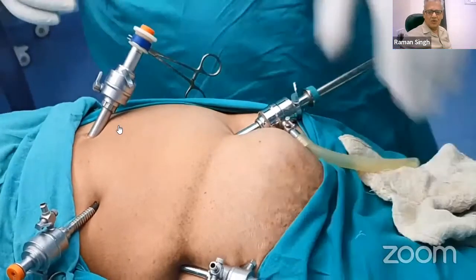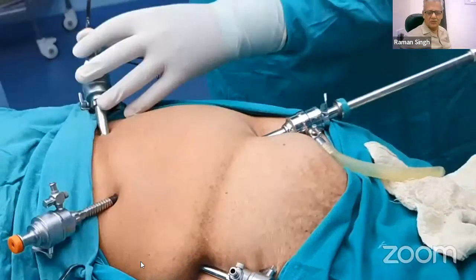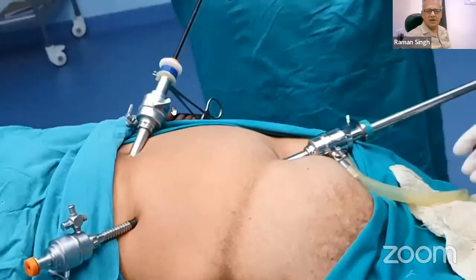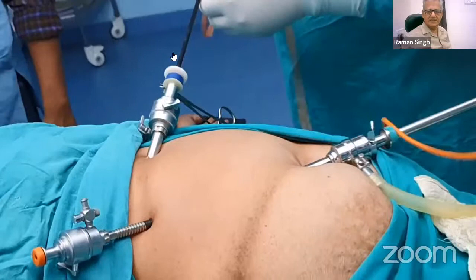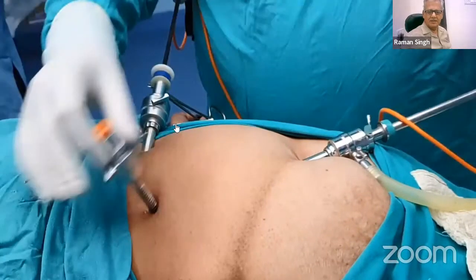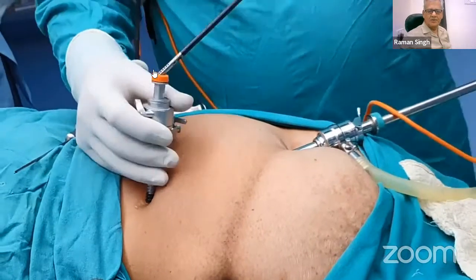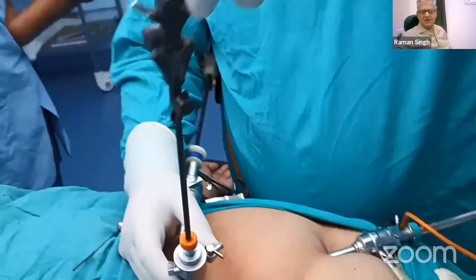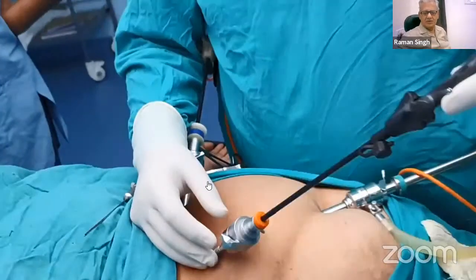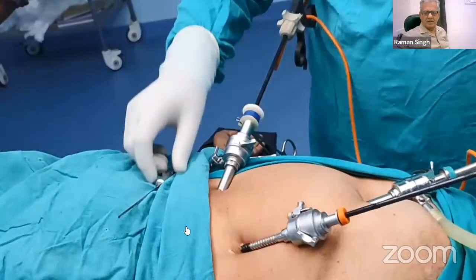So here all four ports are there. This is the camera port. This is the gallbladder, the fundus of the gallbladder is pulled upwards. Now this is the working port. In this working port, this is the dissector, attached with the cautery. This is the third port, where you introduce the grasper to hold the infundibulum or Hartmann's pouch of the gallbladder, to pull it laterally so that we can dissect away.